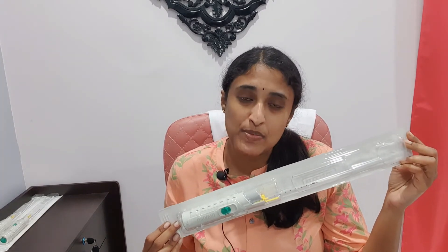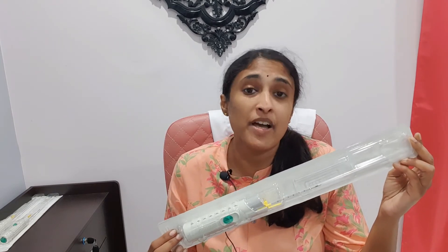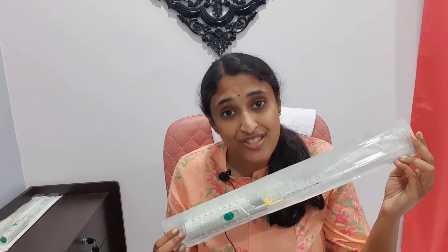The biopsy gun used for a stereotactic core needle biopsy is the same one used by a surgeon for clinical biopsy or by a radiologist for ultrasound-guided biopsy. However, sometimes the diameter can change.